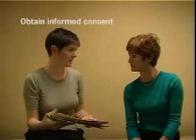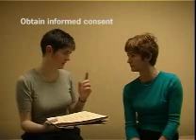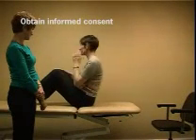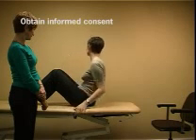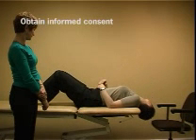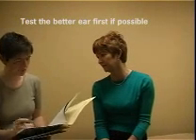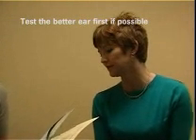Any test should be explained carefully to the patient to obtain informed consent. Sometimes it helps to demonstrate. Proceed with caution if the patient has any history of neck pain or injury. The test procedure may need to be amended. Try to test the better ear first if there are any clues in the history.